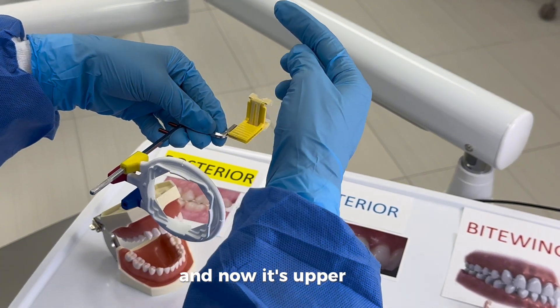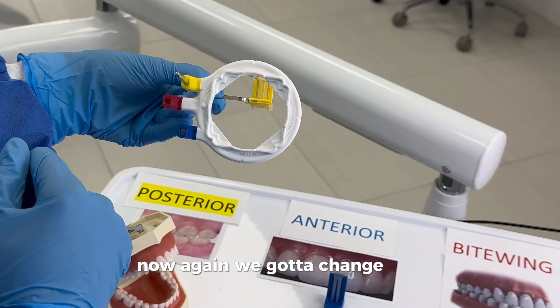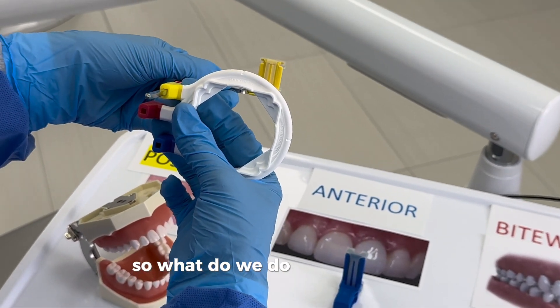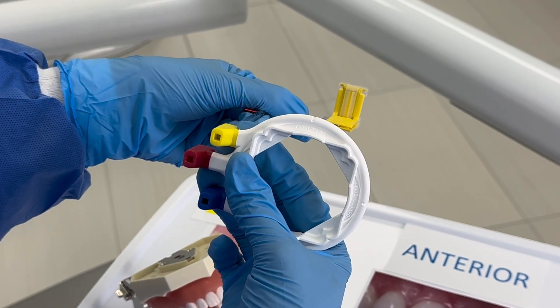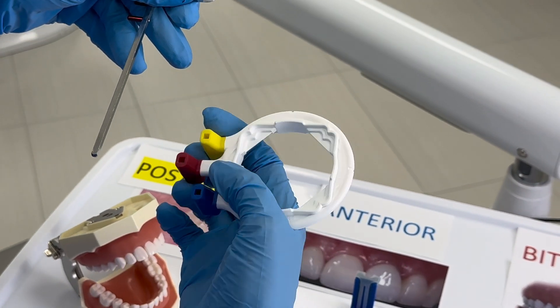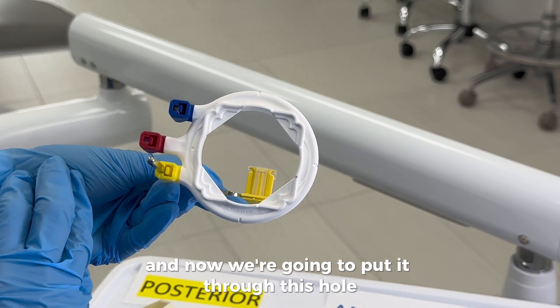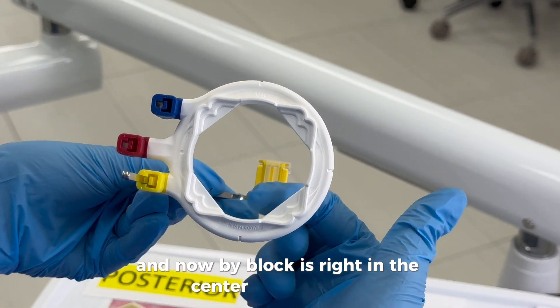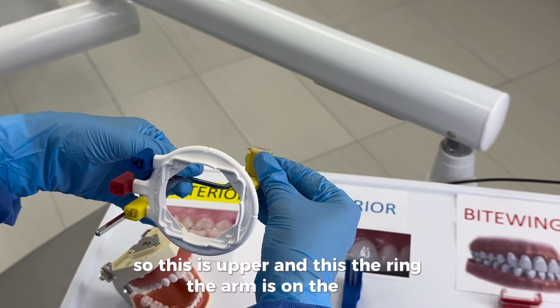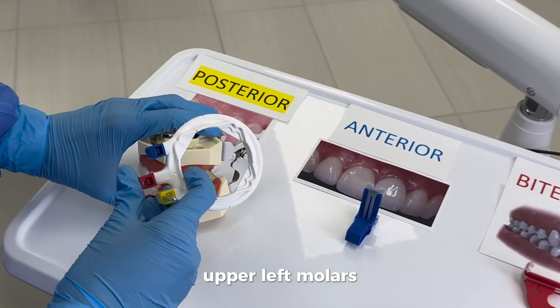Now we have to change the ring because the bite block has to be in the middle of the ring. We take it out, flip it, and put it through this hole — now the bite block is right in the center of the ring. The arm is on the left, so this is upper left. Now we go in for upper left molars.